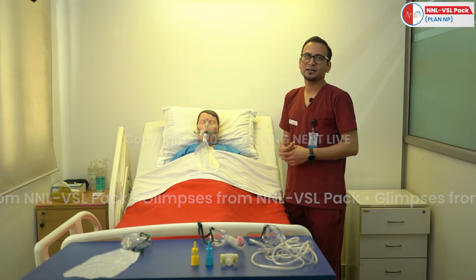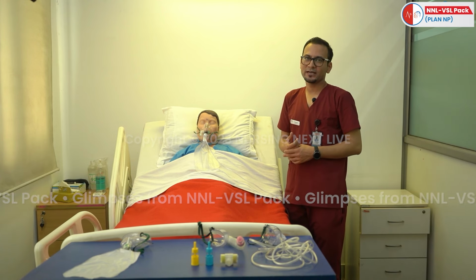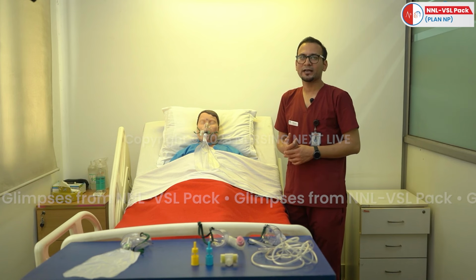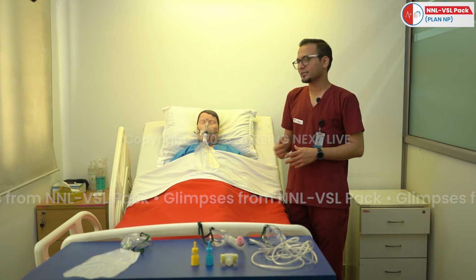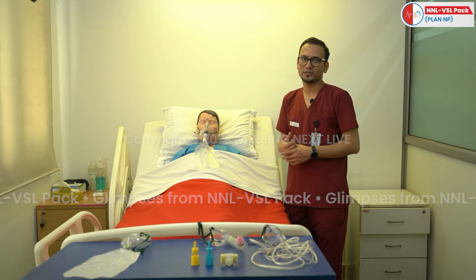And this mask comes under the high flow oxygen devices, and with the help of this mask we can deliver 8 to 15 liters of oxygen, that means more than 90% oxygenation. Why are we delivering 90%? Because in this there is no mixing of air, because there is a flap over the mask area.